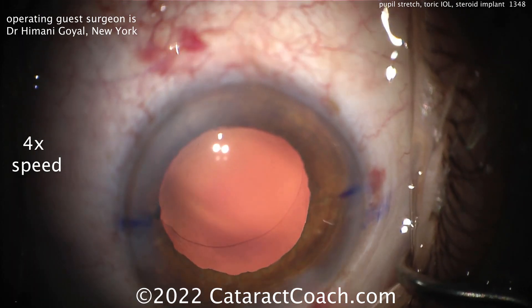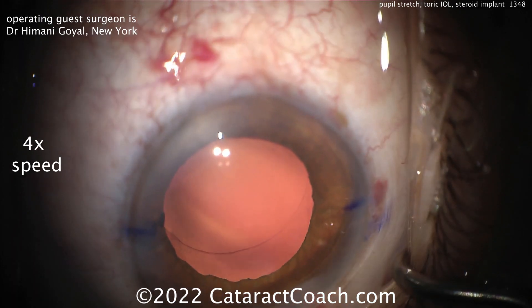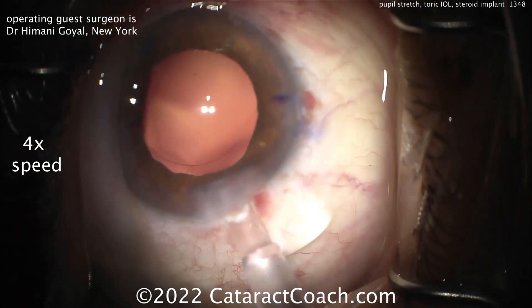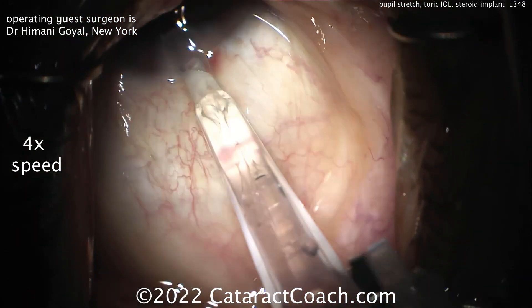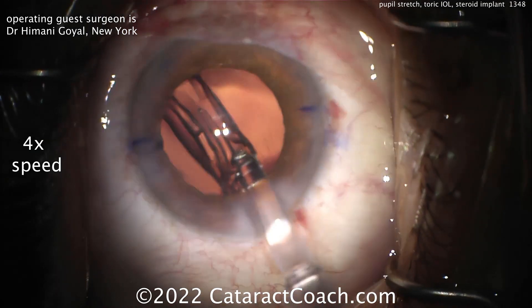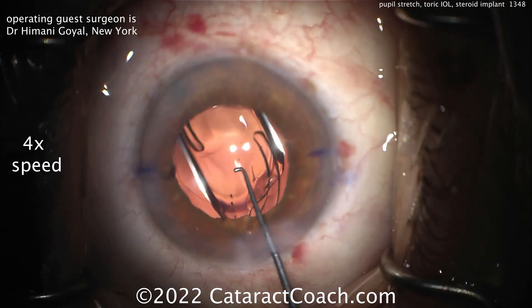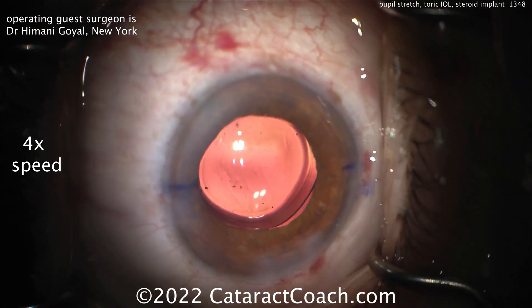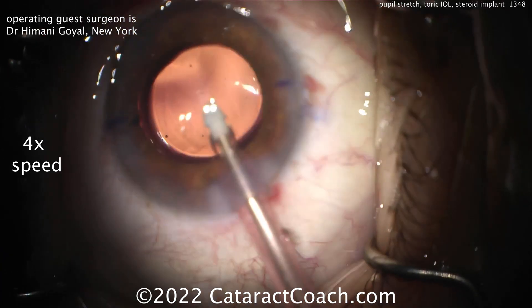We've looked at this before on Cataract Coach — the amount of stretching and the total pupil area afterwards, whether you use a ring or pupil stretching, they tend to be pretty similar. Here comes the toric lens going into the capsular bag. You can see the toric marks at the haptic-optic junction, getting it rotated to the appropriate position.